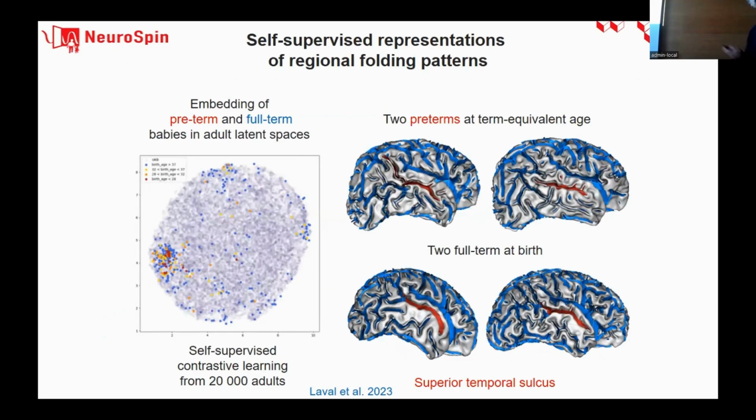And to finish, another kind of application of deep learning, a bit in the same spirit as with the isomap story before: you can ask the deep learning to summarize the variability of a region of the brain in a two-dimensional map. And there it has been done not using any recognition of the structure, just providing a raw crop of the brain. This has been done from 20,000 subjects from the UK Biobank cohort.